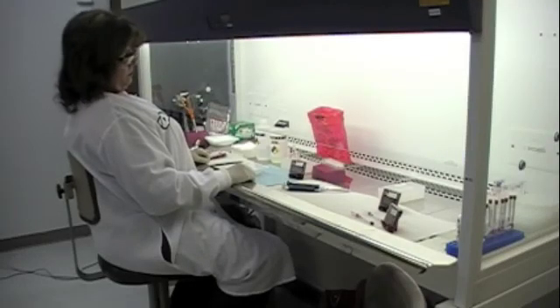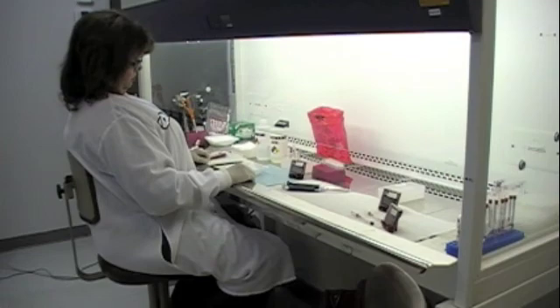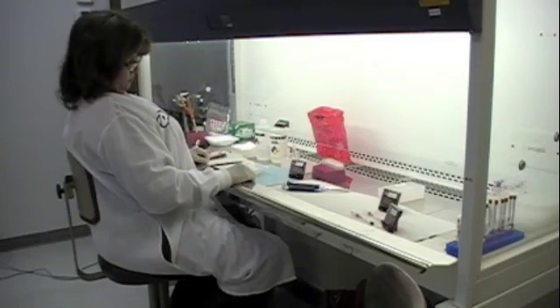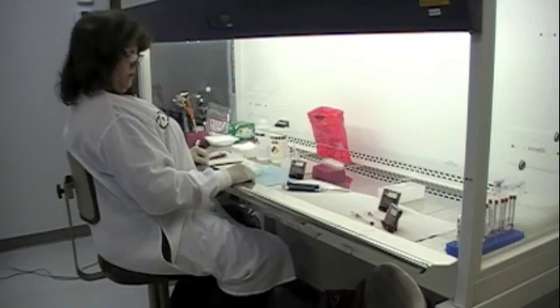We are AHIMA Diagnostic Systems, a manufacturer of in vitro diagnostic tests. Today we're going to demonstrate how easy it is to use one of the screening tests. The test we will use in our demonstration will be an HIV express test, performed using a positive whole blood sample for the HIV virus.